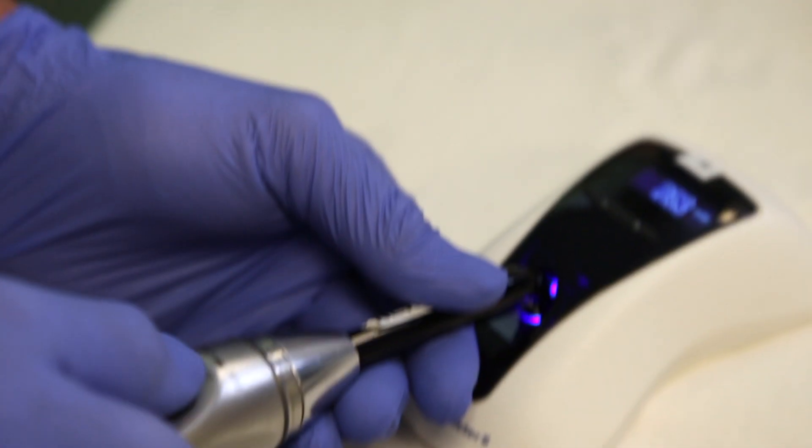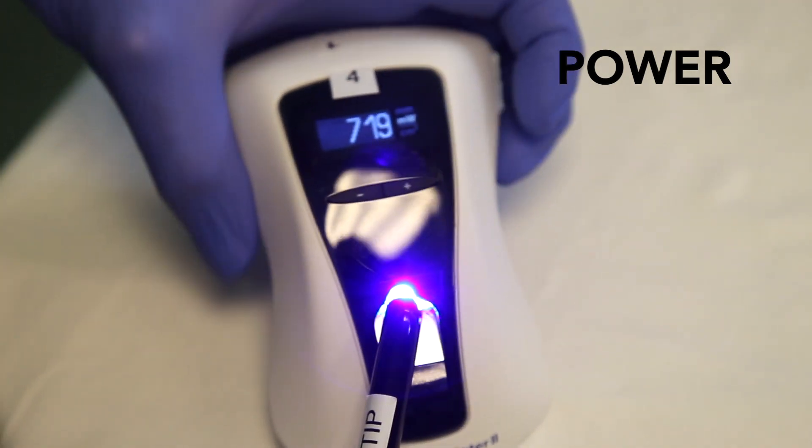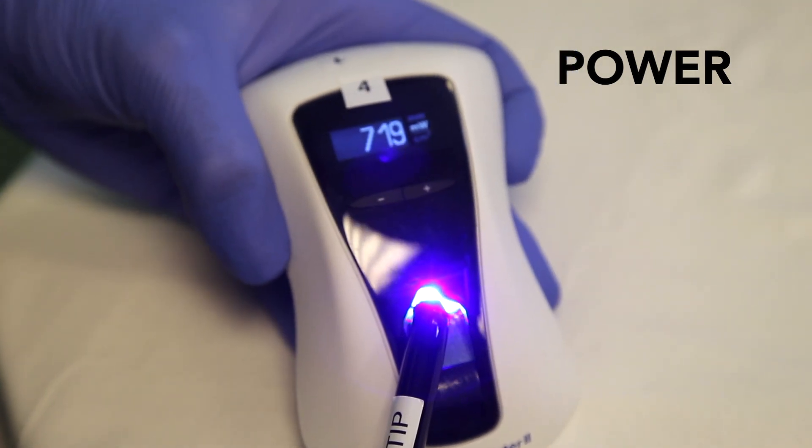I like the Blue Face Meter 2 because it gives you both the power and the radiance from the curing light, and I always like to see the power output from the curing light.